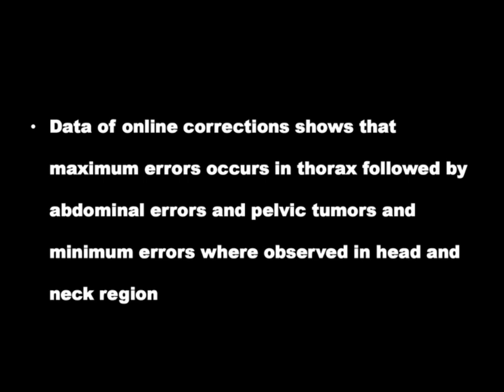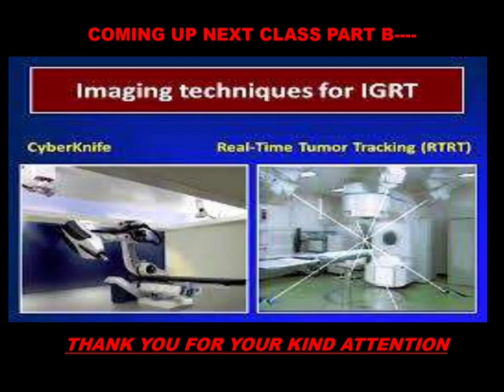The philosophy of rewriting the treatment plan according to the difference between the actual patient anatomy on that given day and the snapshot of the planned treatment is basically adaptive radiotherapy. The final objective is to re-evaluate the situation and redefine daily positioning for radiotherapy treatment to keep on the same track as the predefined and intended treatment plan.